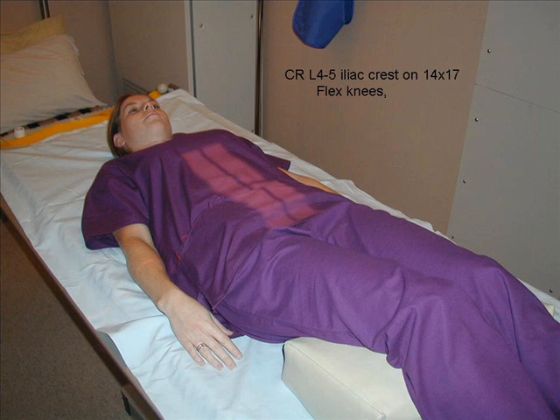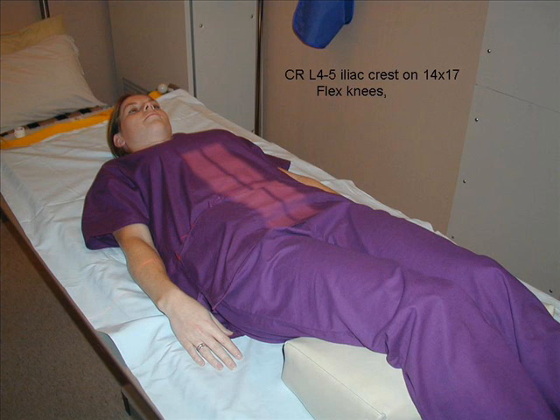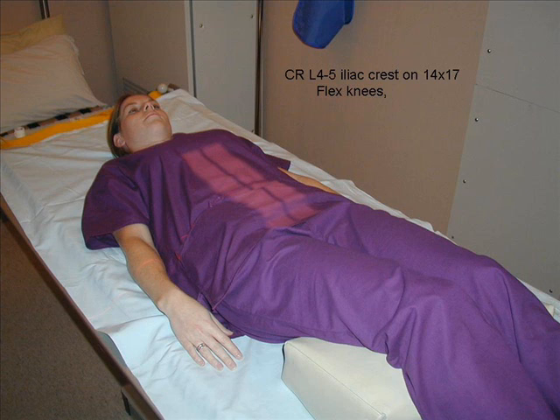Place a lead shield over the gonads of the male. Female ovarian shielding obscures a portion of the sacrum and coccyx.